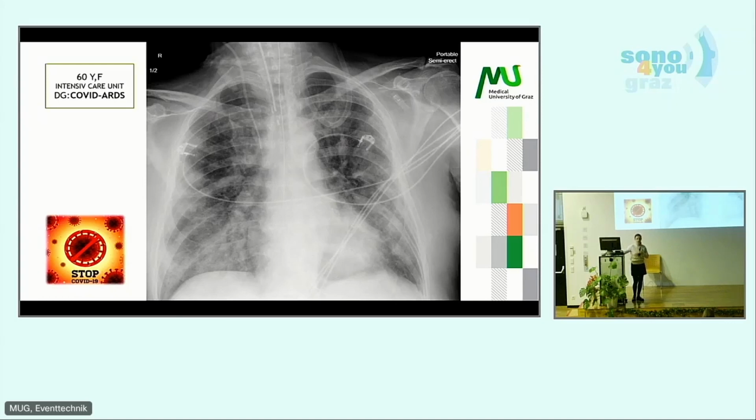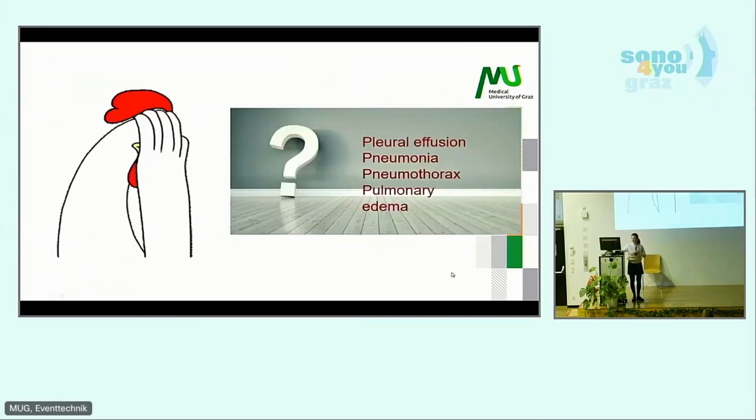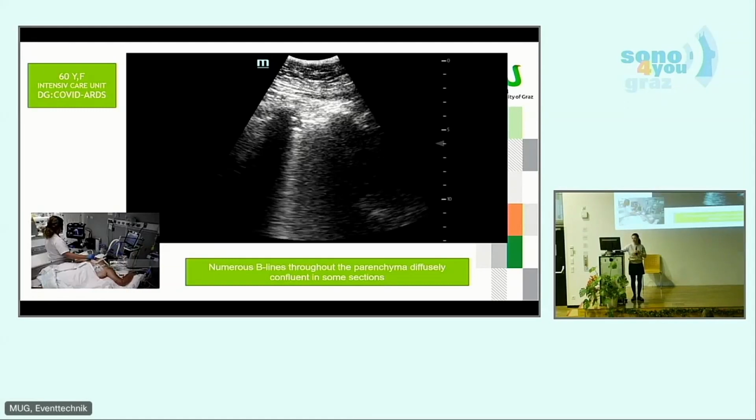Yeah, nothing has changed since the last time. So it's the best that I unfortunately can do. There are multiple questions that anesthesiologists would like to know. Is there a pleural effusion, pneumonia, pneumothorax, pulmonary edema? And I will just say, yeah, maybe nothing has changed. That is good information, for me at least.